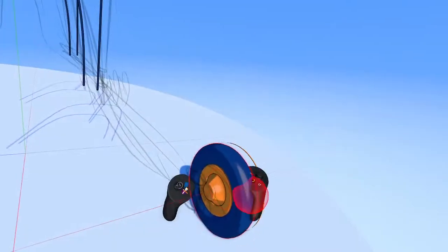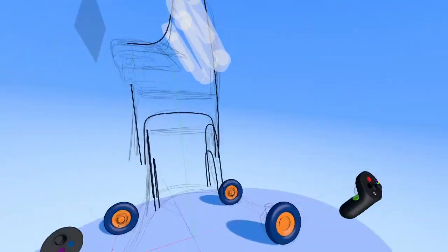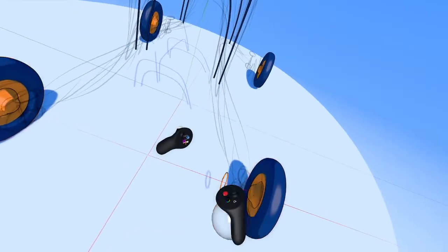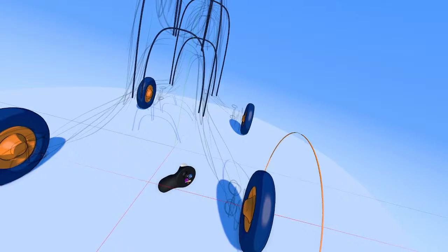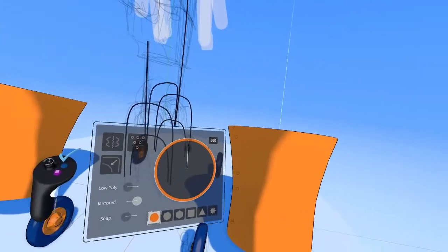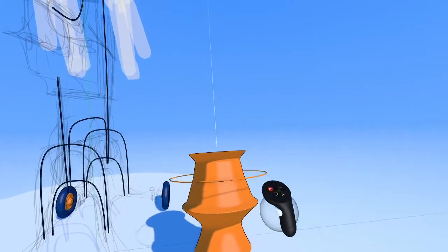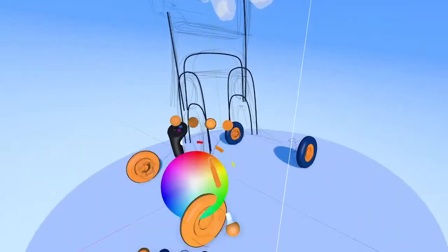We have our general wheel shape here. Let's grab it, hold it, group it together, and duplicate that guy out for the front. All right, and for this pivot point, I'm going to save that for later because I think I'm going to make that out of Sub-D and not the revolve tool. So in case anybody was wondering, if you make a revolve shape like this and take it into edit mode, you do not have an option here to convert it to Sub-D. So when it comes to cylindrical shapes, try and plan that out a little bit. You might want to use a Sub-D cylinder instead of the revolve tool because you might want to intersect geometry with it. Again, I'll show that in a little bit.